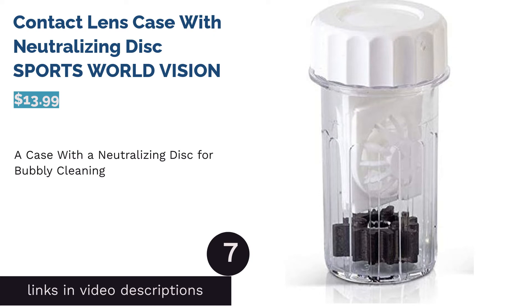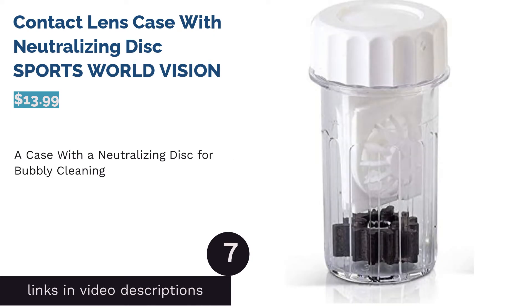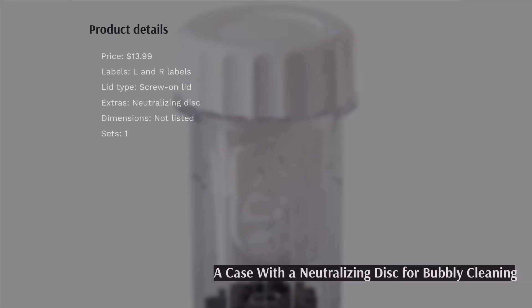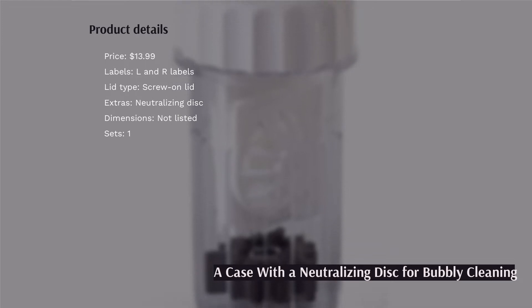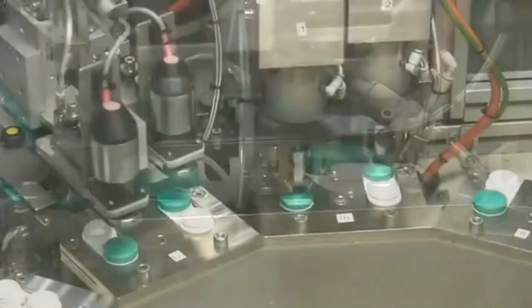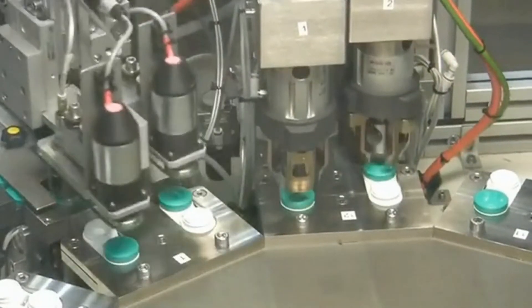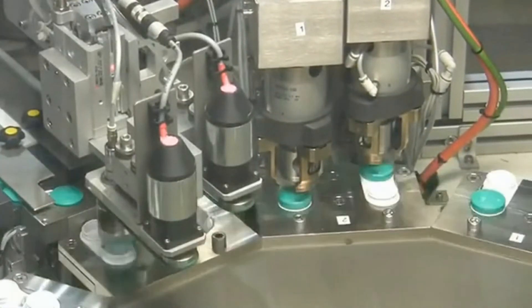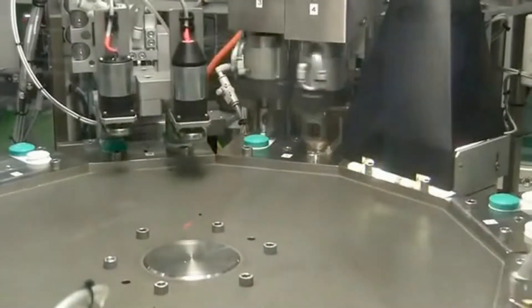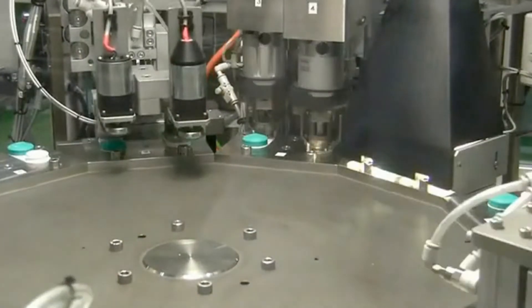The next product in our list is the Contact Lens Case with Neutralizing Disc by Sports World Vision. This contact lens case comes with a special neutralizing disc for lenses that are cleaned with a hydrogen peroxide solution. A neutralizing disc turns hydrogen peroxide into a sterile saline solution, and this chemical transformation produces bubbles. Keep in mind that this case is only meant for peroxide-based solutions. Though it doesn't have a color-coding scheme, it does have L and R labels.